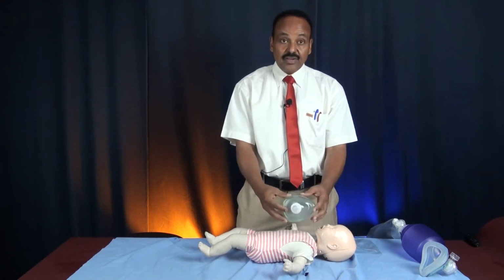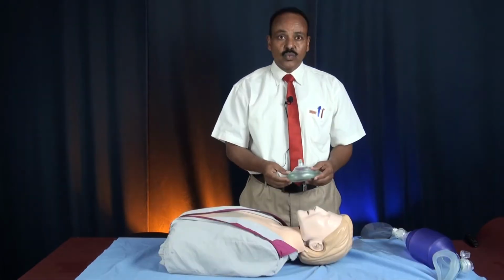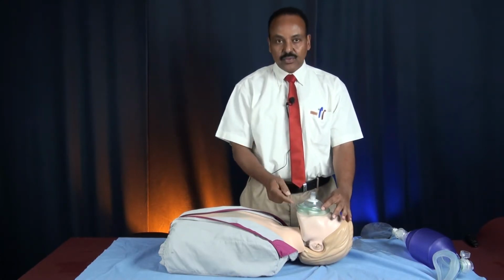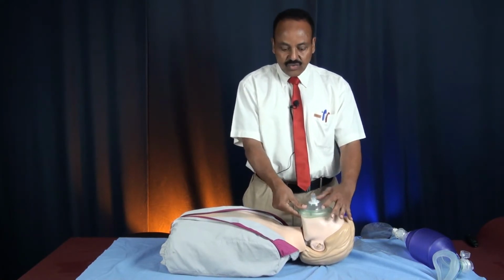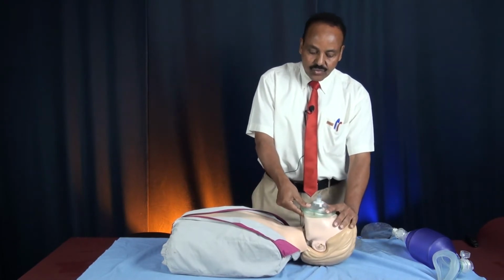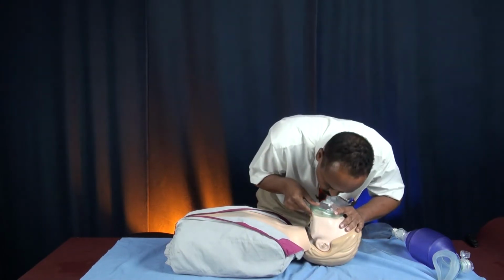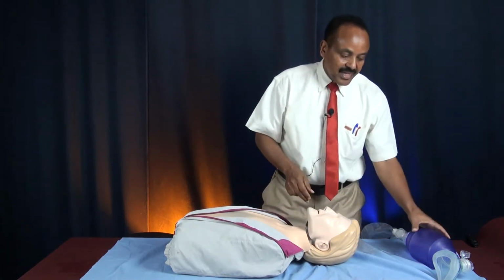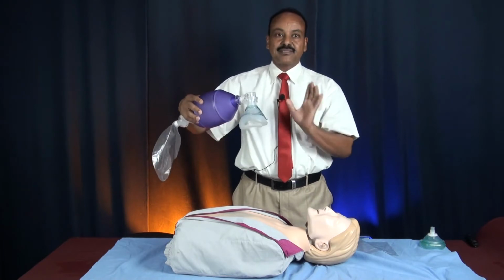This pocket mask is available; you can buy it from a pharmacy and keep it in your car. We place the top on the nose bridge and the broad part on the chin, using 3 fingers and pressing hard to make a good seal. Here you use 2 fingers and tilt the head, chin lift, and you give breaths, watching for chest rise.